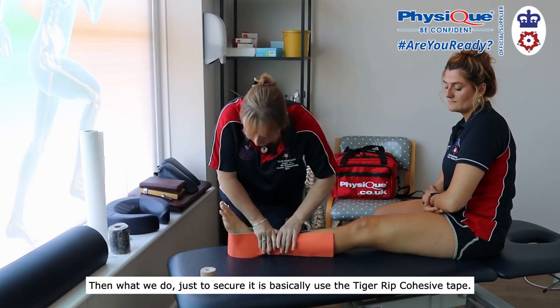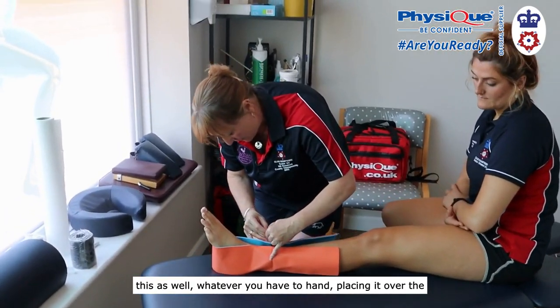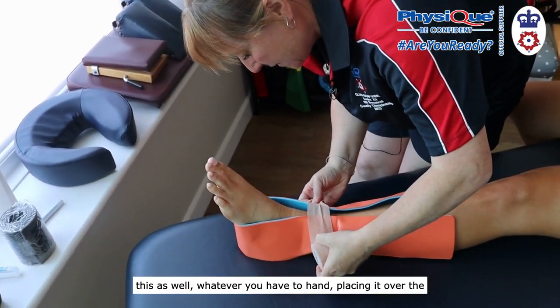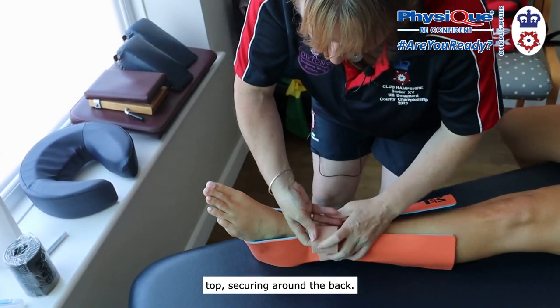Then what we do just to secure it is basically use the rip tape. You can use zinc oxide for this as well — whatever you have to hand. Placing it over the top and securing around the back.